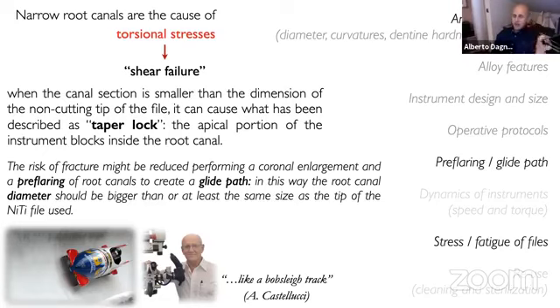I remember every time the words of Arnaldo Castellucci. He told that a root canal has to be considered as a bobsleigh track, where the nickel titanium file is like a bobsleigh. We have to drive it inside the root canal without pressure, without any force.